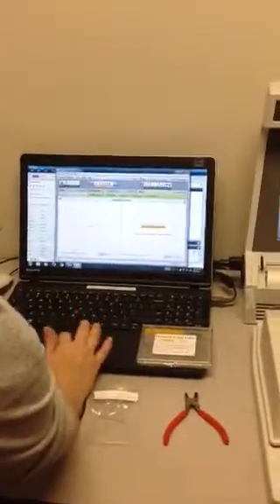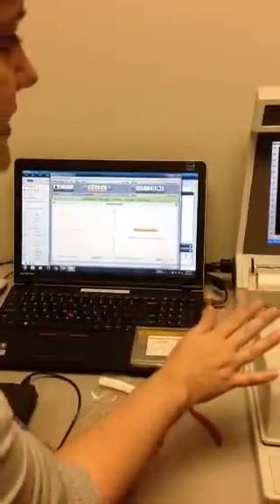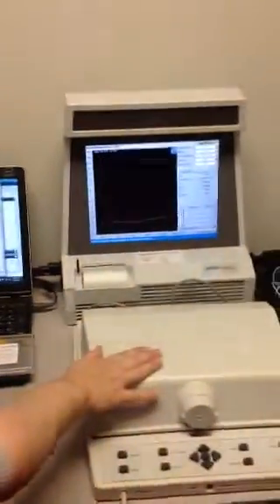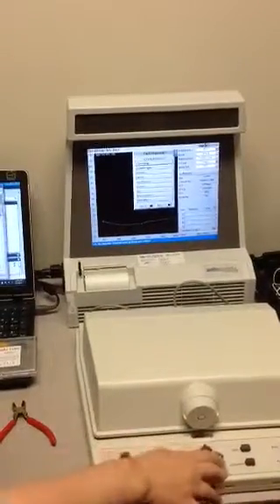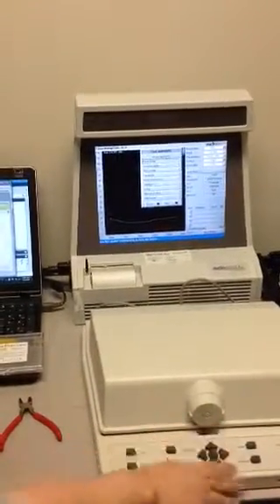Okay, so now into our test settings for the VeriFit. So I'm going to go under the test menu. We want to do an on-ear measurement because we're going to fit the hearing aid to her. We're going to speech map it.